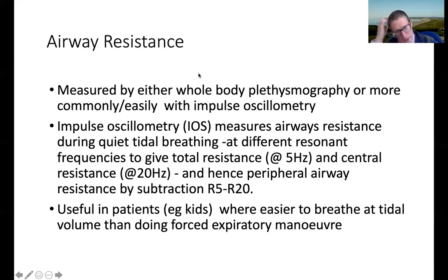Airway resistance, again, I'm just telling you this for information purposes only. You can measure resistance using something known as a body box or a whole body plethysmograph, or more commonly nowadays, we use something called impulse oscillometry. Impulse oscillometry measures airway resistance during quiet tidal breathing. So it means you don't do a forced expiratory maneuver. So it's very physiological because it's done with normal breathing.